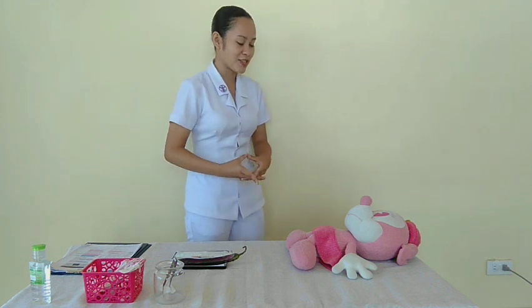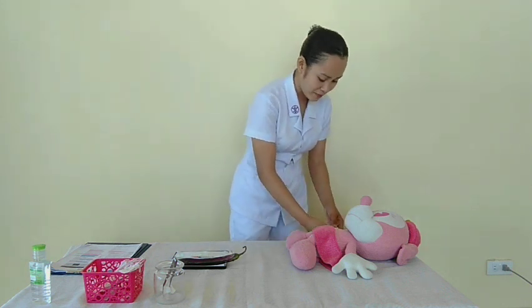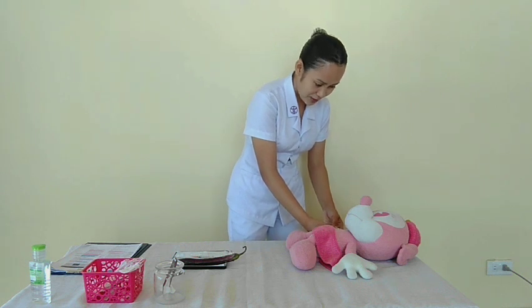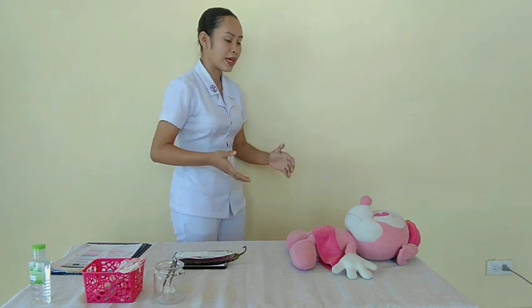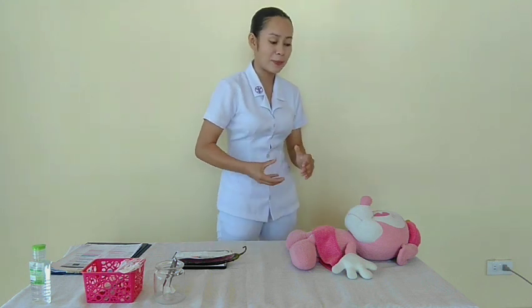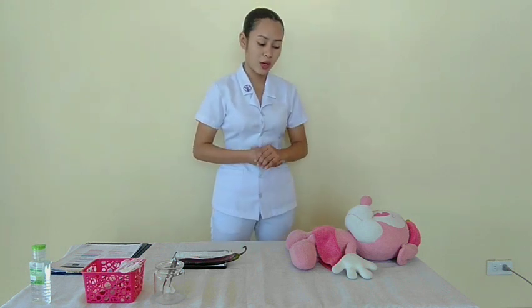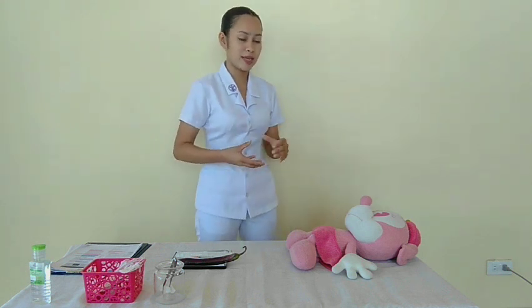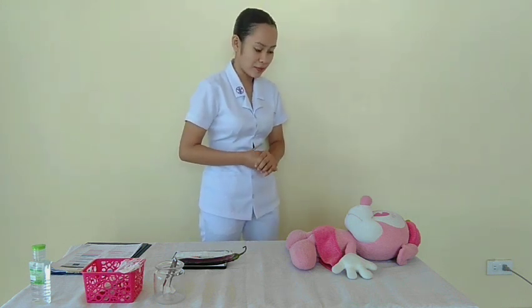Good morning ma'am, my name is Parenteral, a student nurse at Davao Doctors College. May I see your ID, ma'am? And please state your complete name and your birthday. Okay, and what do you want me to call you, ma'am? Okay, today ma'am I'll be administering your insulin to help your body control the blood sugar for your type 1 diabetes, and I'll be injecting the insulin in your abdomen. Okay? Do you have any questions or clarifications? Okay, now.